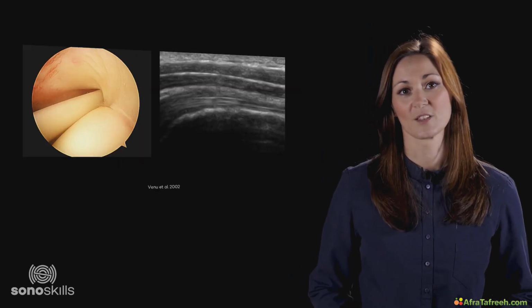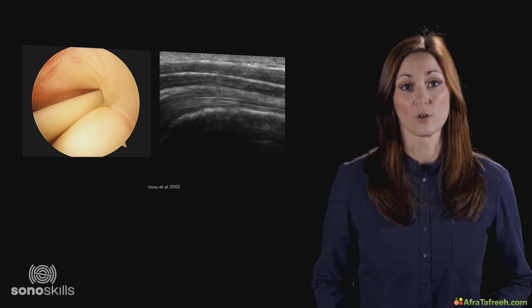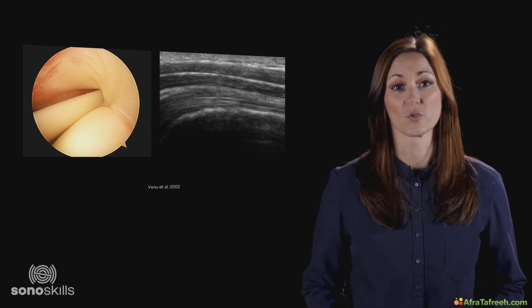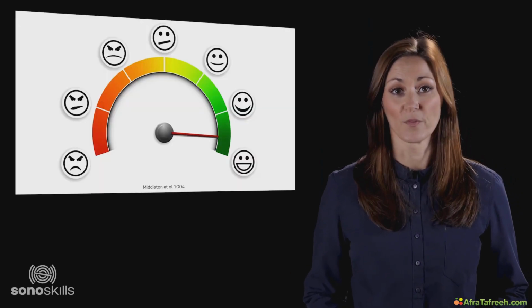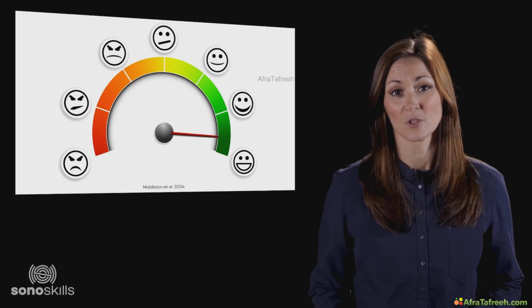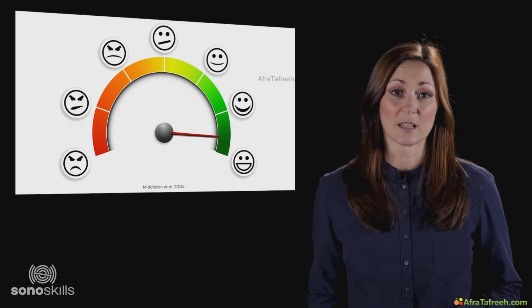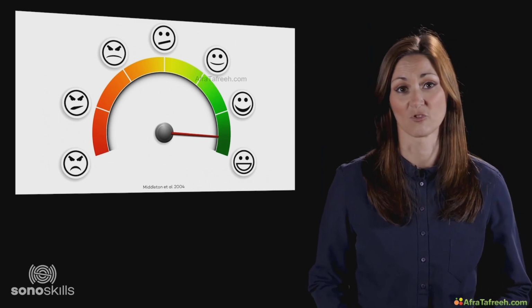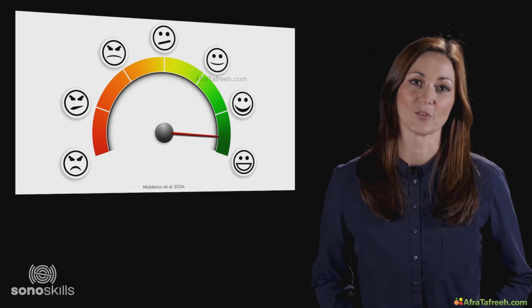The advantage of musculoskeletal ultrasound compared to an arthroscopy of a tendon, for example, is that with ultrasound you can see the status of the internal architecture. This is of course not possible with an arthroscopy. Patients actually prefer ultrasound examination to MRI. They say that MRI is very loud, it requires that you're not claustrophobic, and you're not able to move during the exam. Furthermore, it requires the removal of metals and makeup, etc. In general, ultrasound is regarded as being more patient-friendly.